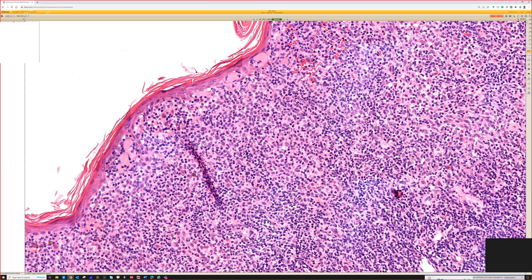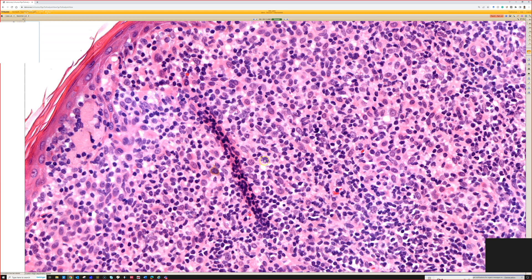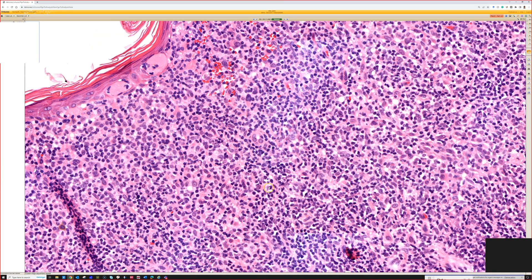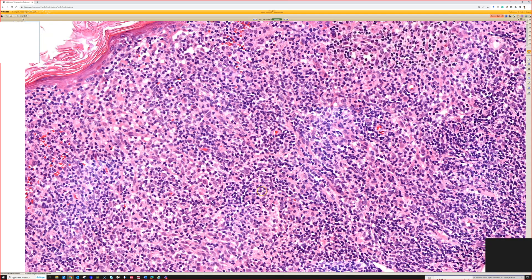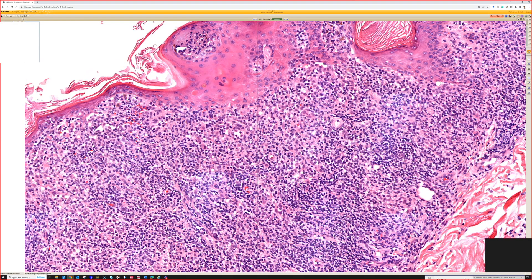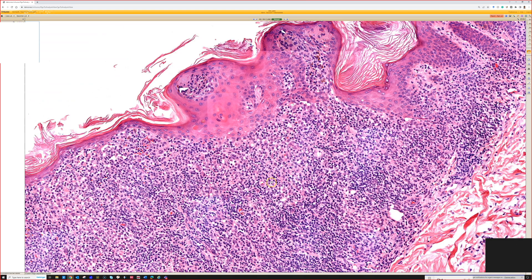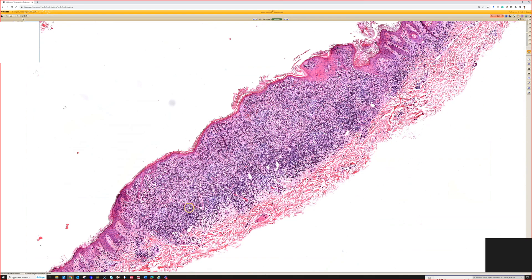There's one mitosis — that's okay. First, I don't know if that mitosis is in an inflammatory cell or a melanocyte. Even still, we see single mitoses in nevi regularly. Studies have shown that if you carefully examine a series of nevi, you'll find a mitosis in something like 25 to 30 percent of them. So one mitosis does not make melanoma.